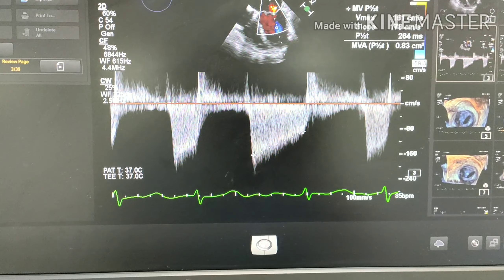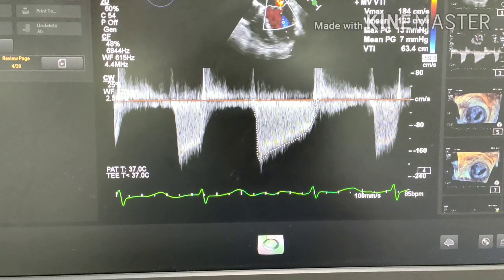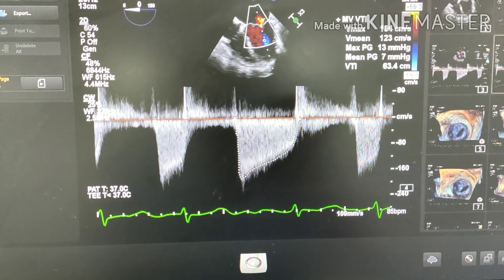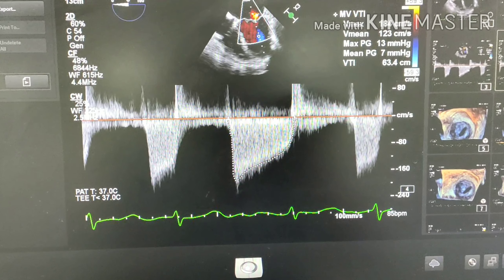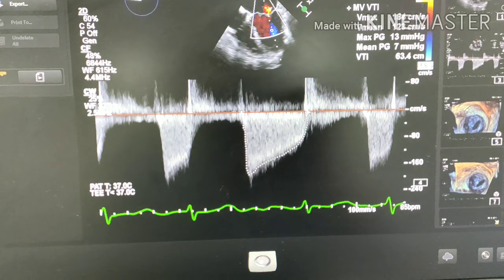If you actually measure the profile, you see the mean gradient is around 7 mmHg, which makes it moderate. But it is very difficult to stamp that 7 mmHg gradient as just moderate and not severe, because the patient is in AF and the envelopes are variable.